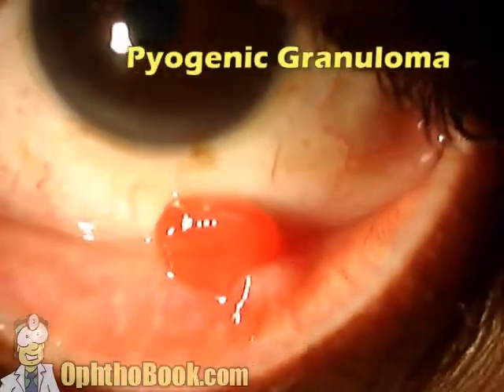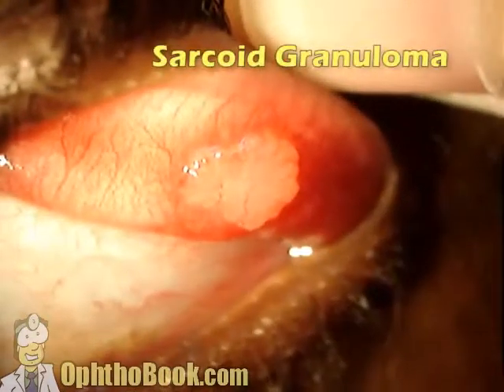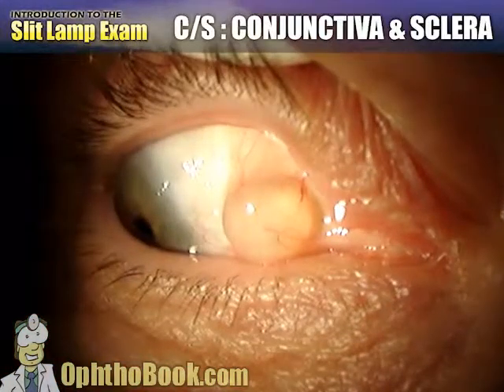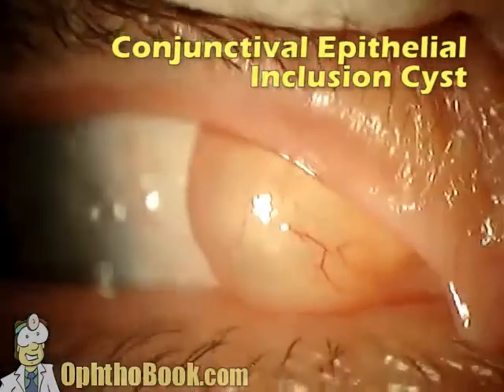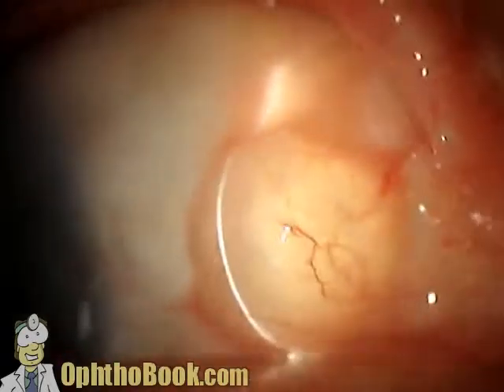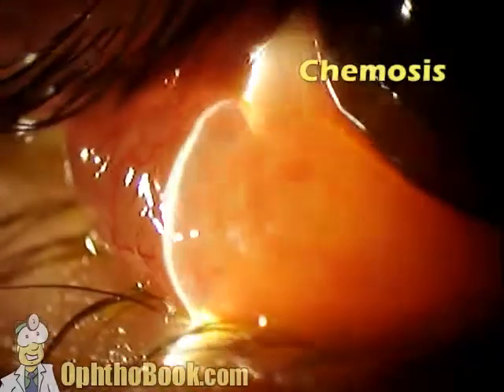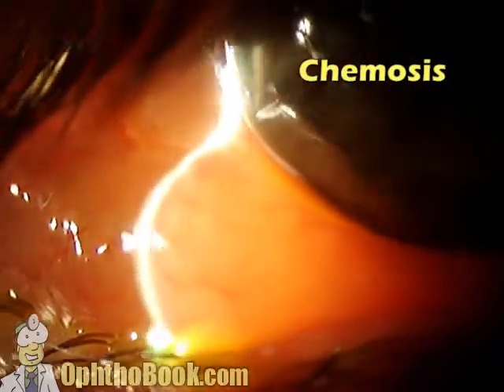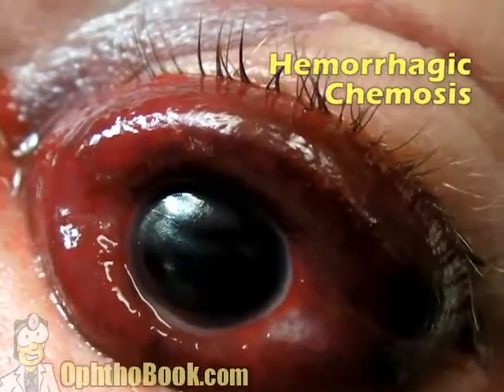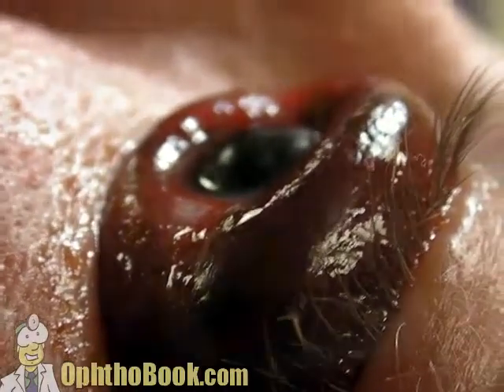Why do I flip the eyelid? Because sometimes you have things like pyogenic granulomas, associated with chalazions. Here's another lesion on the upper lid — some type of granuloma we biopsied, which turned out to be sarcoidosis, helping us diagnose that disease process. Looking at the conjunctiva and sclera: here the conjunctiva has a very large cystic structure — benign because it's clear, and you can use a thin slit beam for a cross-section. This is chemosis, usually associated with allergy — a very puffy allergic response. And this is hemorrhagic chemosis — blood under the conjunctiva bulging forward, quite impressive how far forward it can go.